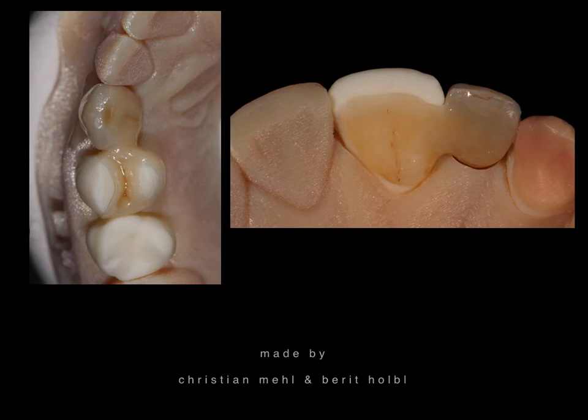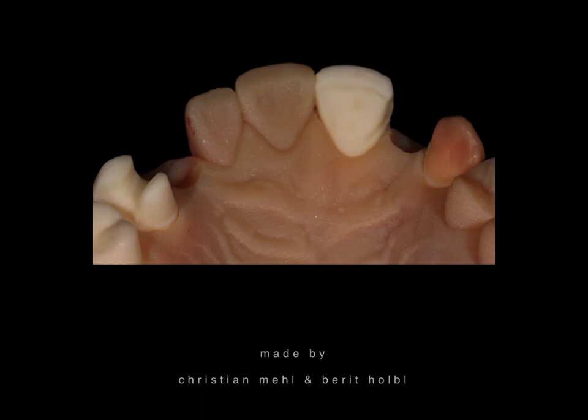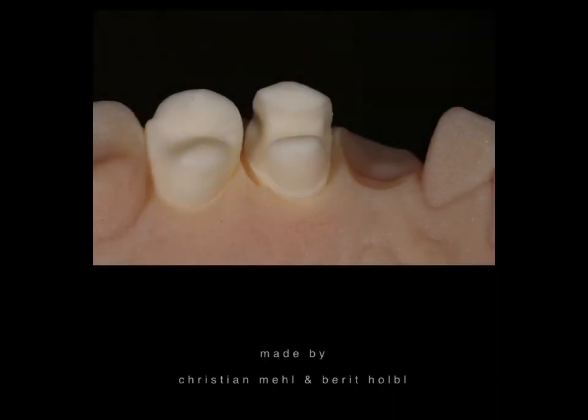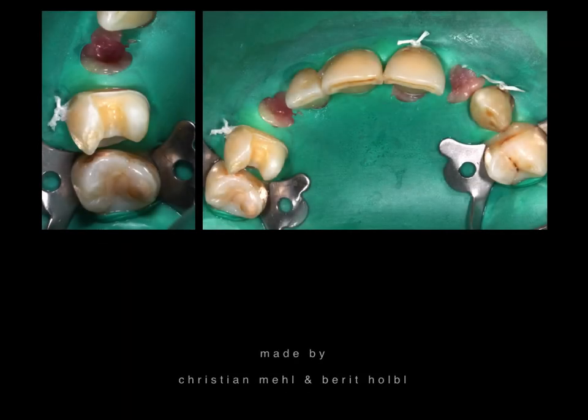On the right side is a conventional Maryland bridge with the most up-to-date materials — absolutely colorful and beautiful. The scientific data for this type of bridge is completely sufficient, with a high success rate over many years. This is the printed model again, showing the preparation for both the posterior and anterior teeth — four ceramic bridges, just painted, absolutely perfect.